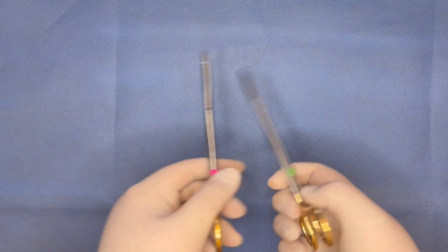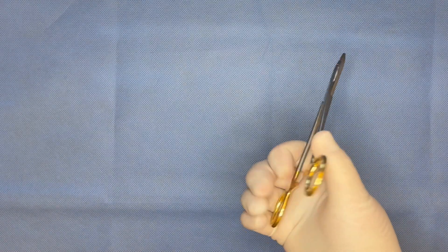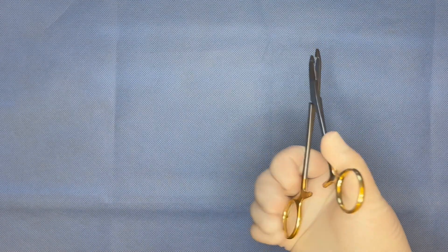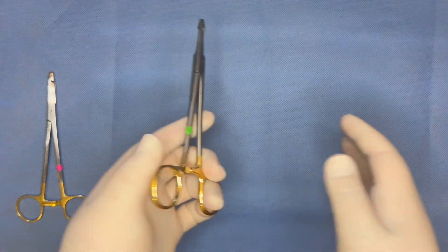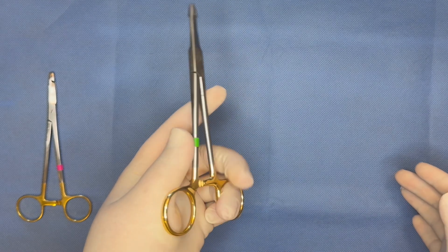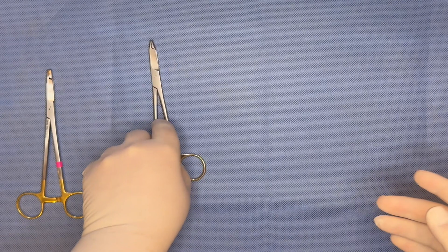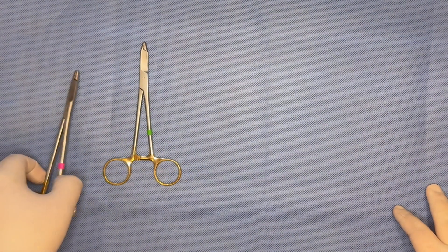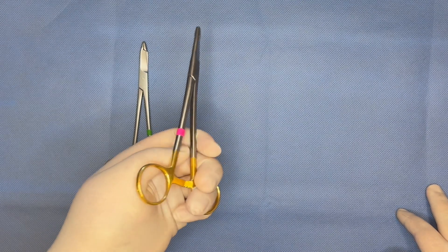It is also important to have the correct instrument if you want to suture with a palm grip. Because the palm grip has no mechanism to pull on the upper arm, there is no way to overcome the mechanics of a right-handed needle driver in your left hand. You can see here that when I try to use a palm grip with my left hand, I am unable to open the box lock. Switching to the left-handed needle driver allows me to use a palm grip if desired.